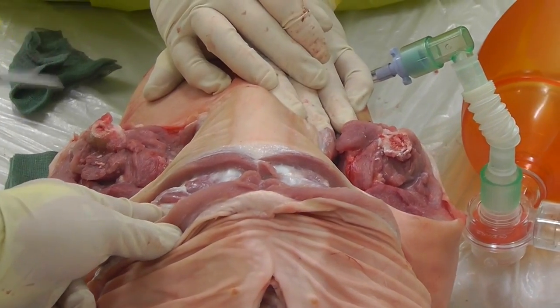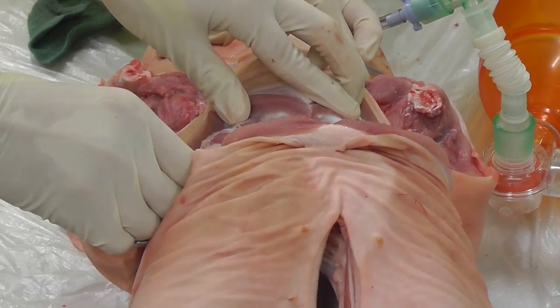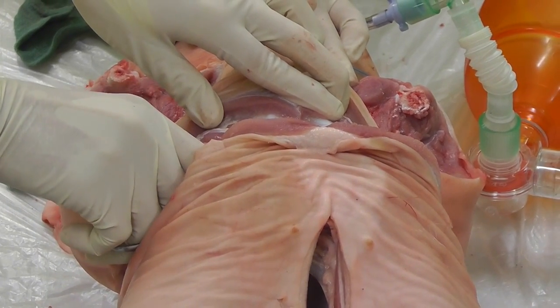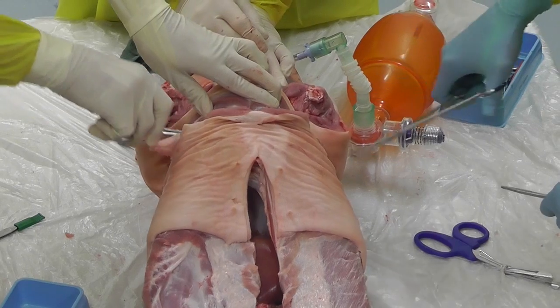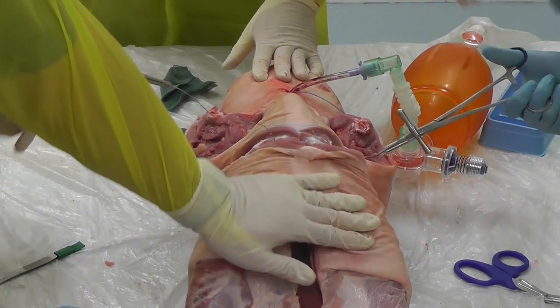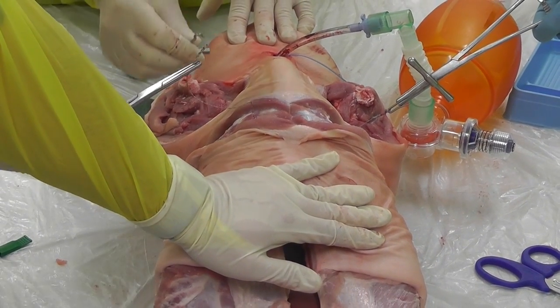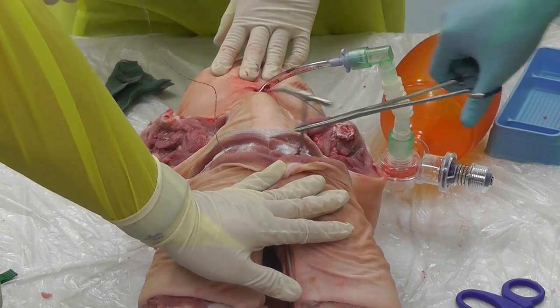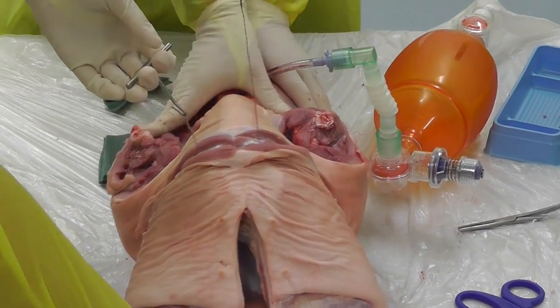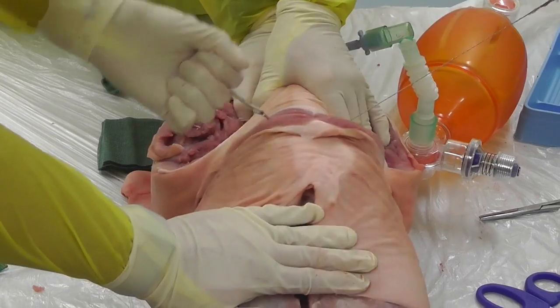At this point, identify your sternum. Put a pair of forceps underneath the sternum and get it out — your mate is going to pass you your gigli saw. Remember it is like a cobra — every time it comes near it wants to bite you and penetrate your glove. You are going to need some stability. Watch the flick as the wire comes through the sternum. Either use your forceps or the gigli handle to get it through. Good, confident, efficient movement. If you are sympathetically activated it is going to be difficult — hold the distal section and punch it on top. Nice flat movements through the whole course of the wire.